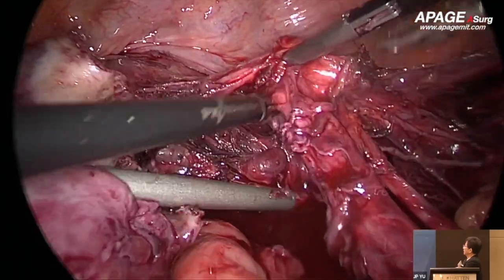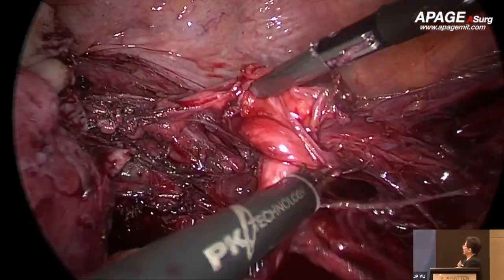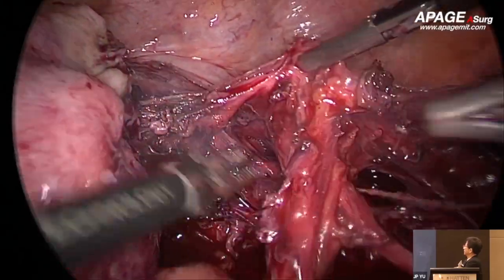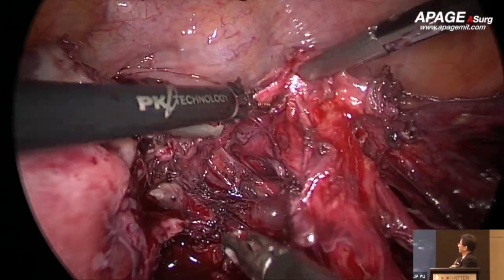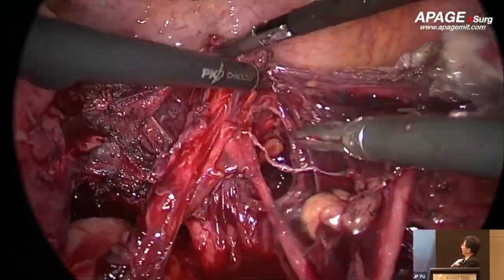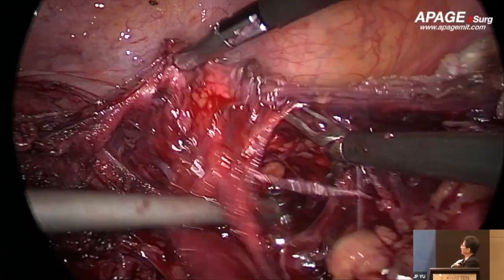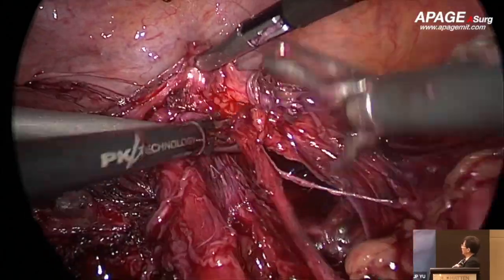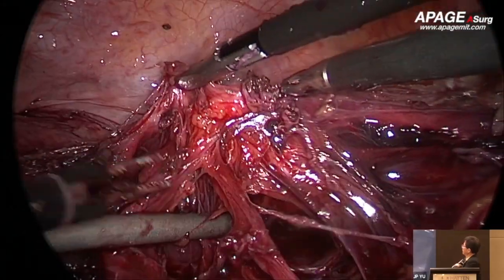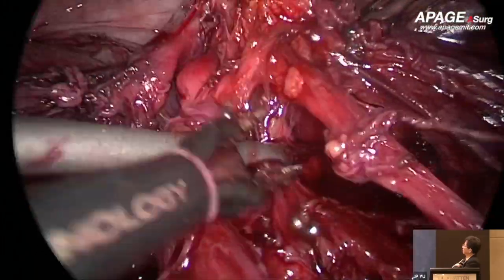Okay, so the ureter here, and this is the uterine artery. Because of the early stage 1A, we are just doing the modified radical, not the standard radical hysterectomy. So we don't take a lot of the parametrium and it is preserved, but also the hypogastric nerve has been preserved. Here is the ureter and the uterine artery crossing over the ureter here.